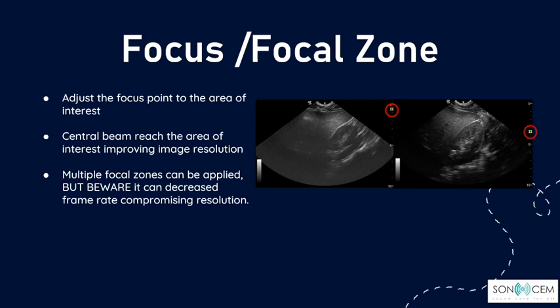Lastly, take advantage of the focal zones. As we have learned earlier, the focal point is a narrower segment of an ultrasound beam with the highest lateral resolution. This focal point indicator is present at the side of the screen, and the position of the focal point can be changed to the area of interest to achieve better image resolution.